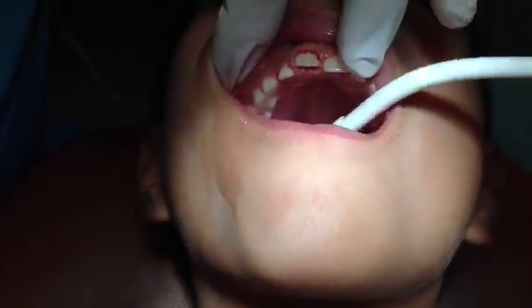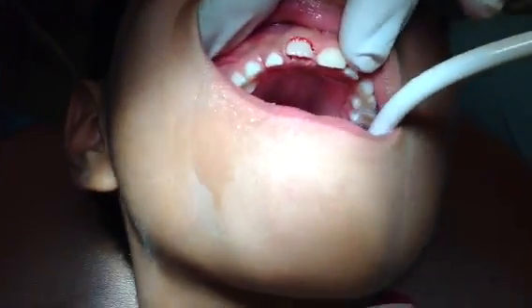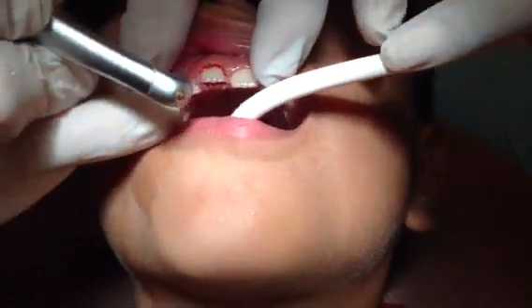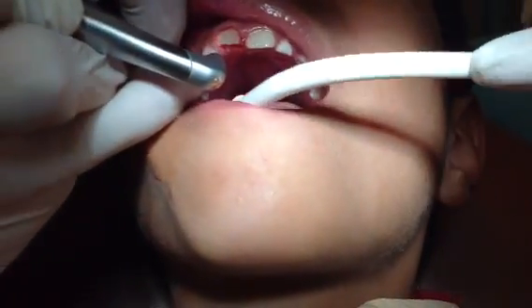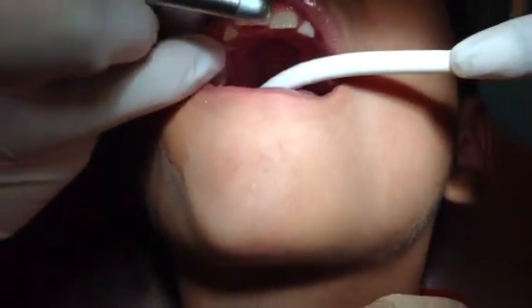Okay. And now you can see the tooth is exposed, right? Now we're just going to clean the tissue up just a little bit, make it look a little bit prettier, and then things will heal in very nicely.